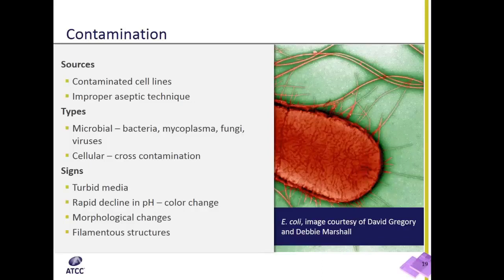Bacterial and fungal contamination are the most commonly seen problems in labs. They can appear quickly, but fortunately are also easily detected. Turbid and acidic media usually indicate the presence of bacteria. Cell stress from microbial contamination may also lead to morphological changes. Fungal contamination is seen by the appearance of obvious filamentous structures in the media. At least one thing about this kind of microbial contamination is that it's easily detectable.